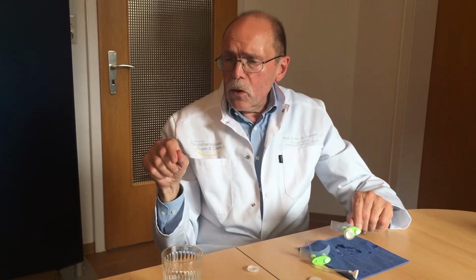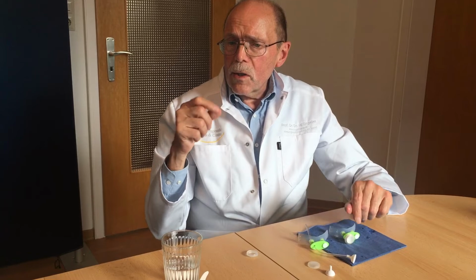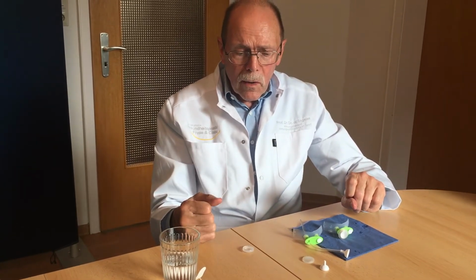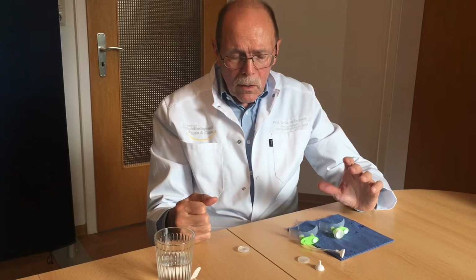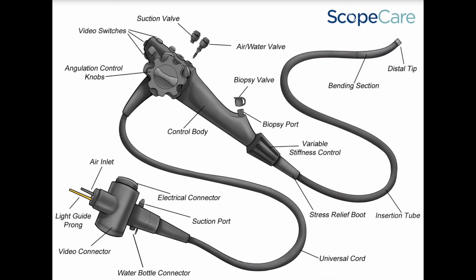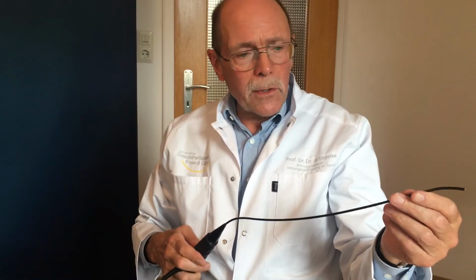I've got my endoscope, and I will place it into the position where this Donder space can be observed. Here we have a flexible endoscope.